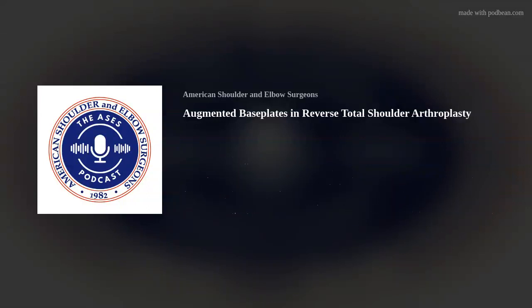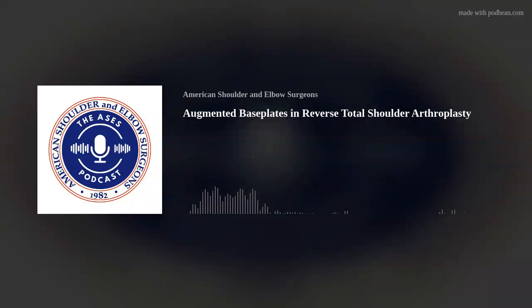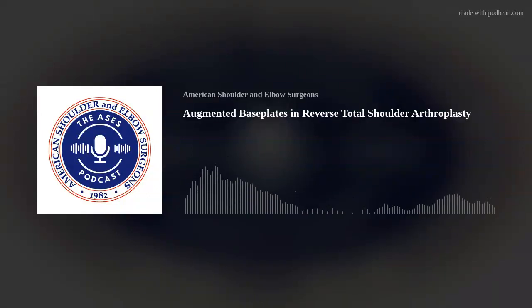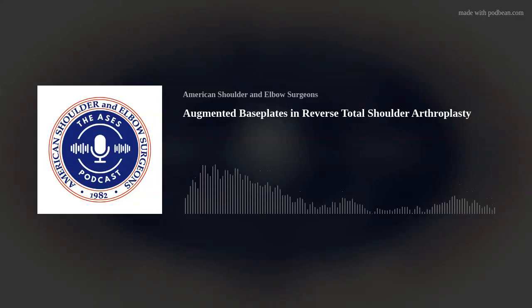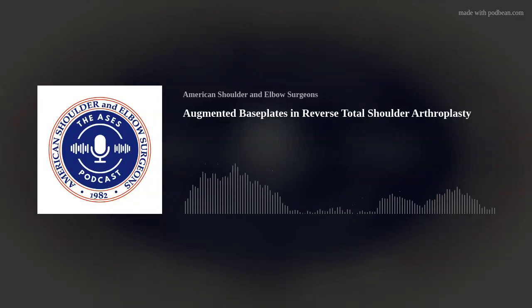where you're targeting. And I think it's reasonable in these situations to make sure that you have a really good exposure on the anterior glenoid, so you can see the anterior glenoid neck. You can get your finger past whatever soft tissue, subscap tissue is still there, so you can feel what you're aiming for. And one thing that I've done more recently, if I'm struggling to really get a sense of the anterior glenoid, is I will tenotomize the conjoint tendon, and if need be, repair it at the end. If not, let it fly.